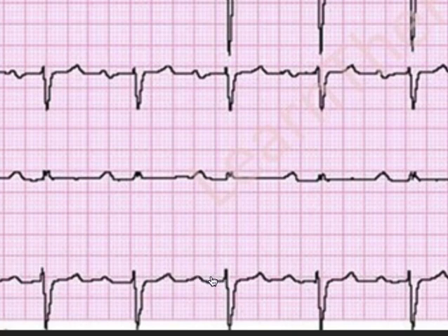In simple terms, first degree heart block is a condition in which the wiring of the heart is still intact, but it is slow. The conduction is slow. That's why the PR interval is increased. The conduction wire is intact, but the conduction is slow. Therefore, it takes longer for the electrical impulse originating from the SA node to reach the ventricles and for the ventricles to start contracting, or ventricular depolarization.